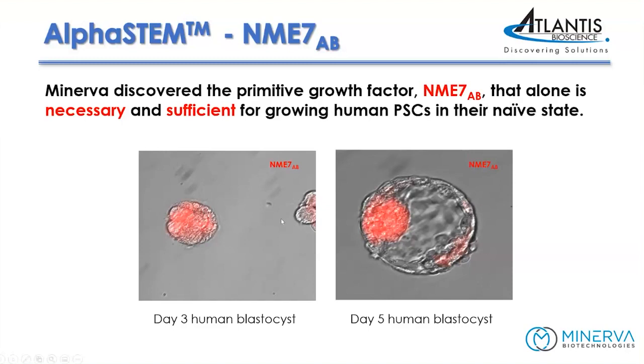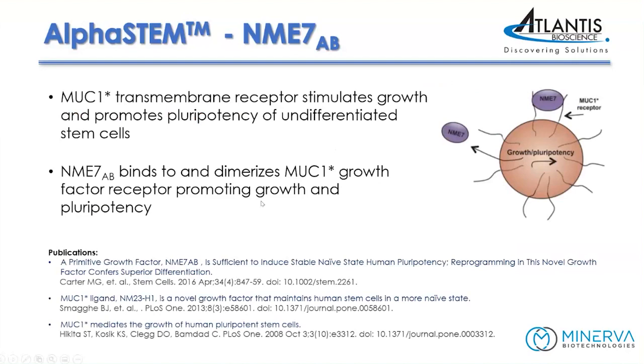How it works is that it utilizes a naturally occurring growth factor, NME7AB, to support the naive state in human stem cells. This growth factor is expressed in the earliest days of embryogenesis, in the inner cell mass of the human blastocyst. It is then later turned off during development.